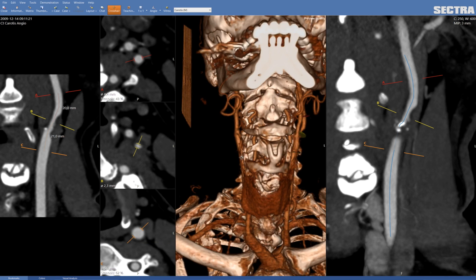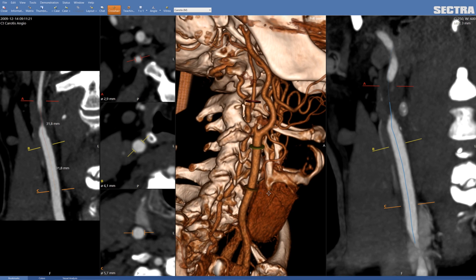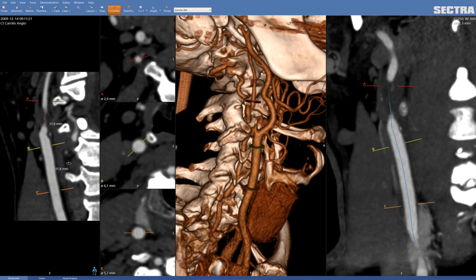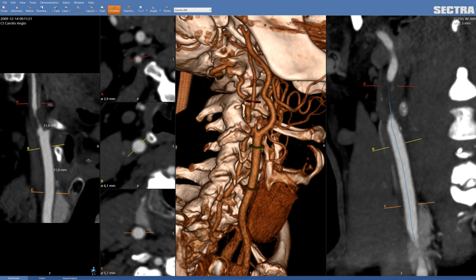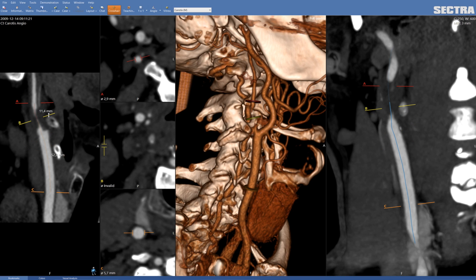If I want to measure the other side, I can do that by pressing one marker here, and I need to add one more marker since the contrast in this vessel is really low — it's almost occluded. Even though it's a really thin line with contrast, the software has no problem finding the center line. Since it is a really thin line, you need to support the software in finding the right diameter of the vessel.